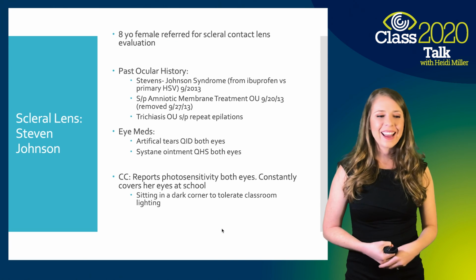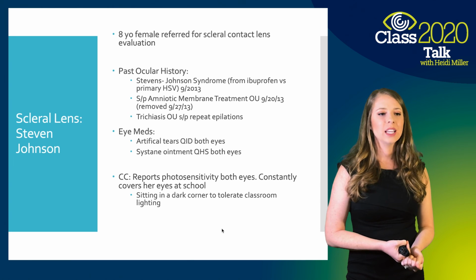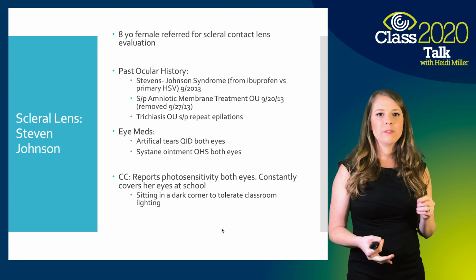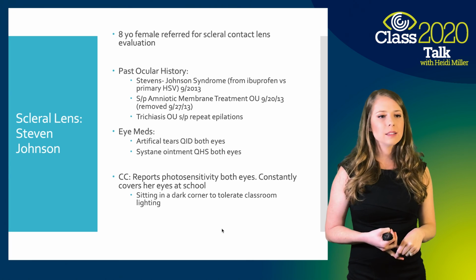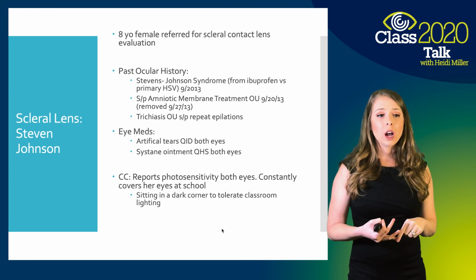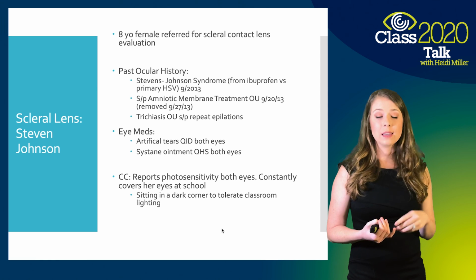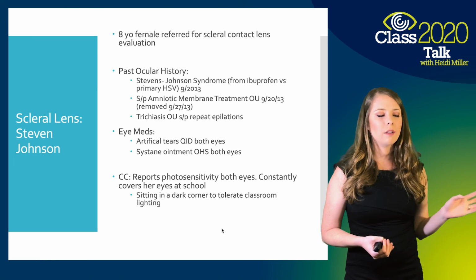Last patient case for today. It's an 8-year-old female referred for scleral contact lens evaluation. This patient had Stevens-Johnson syndrome, and they're not sure if it was from taking ibuprofen or if she maybe had a herpes simplex virus type of reaction, but she had undergone 2 amniotic membrane treatments before coming to see me. And she also had trichiasis that they were treating with epilations at follow-up visits.